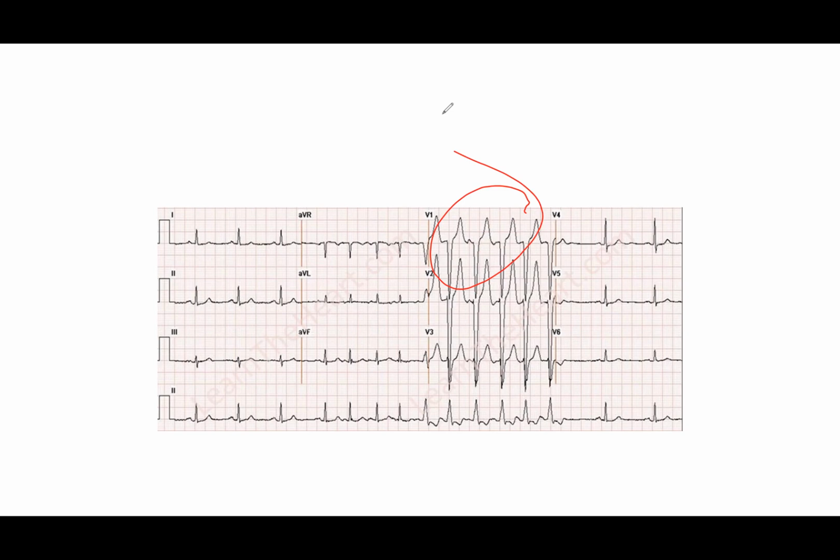But in medicine in general, and especially in EKG, there's an exception to the rule. You can have a patient with SVT, which you think of as a narrow complex. Well, it's supposed to be a narrow complex, but you can actually have what's called an electrical aberrancy.